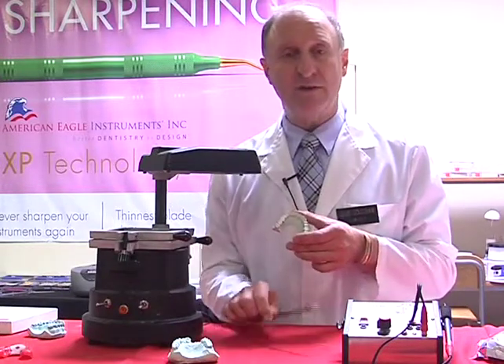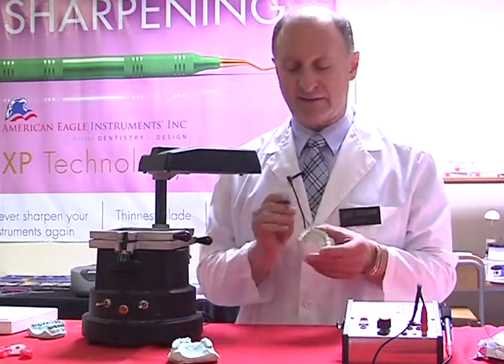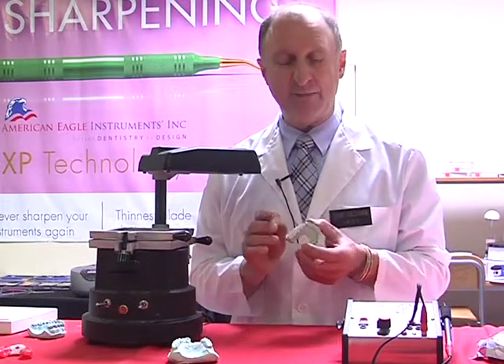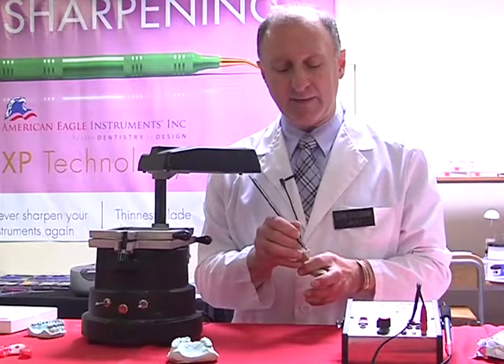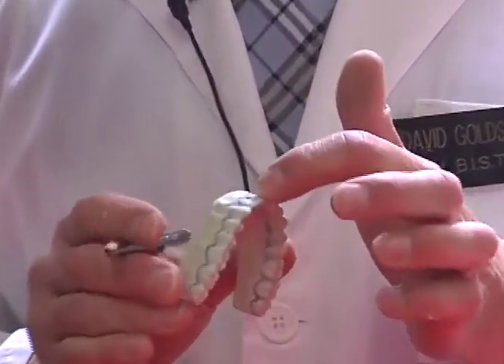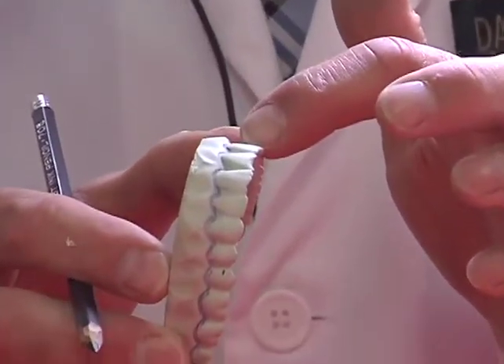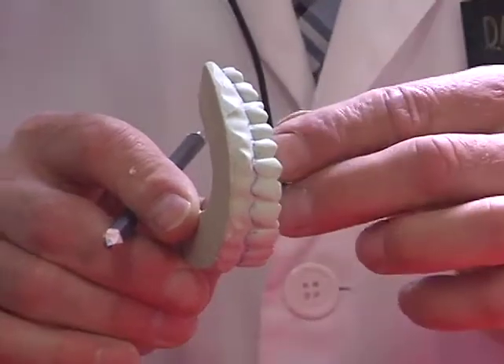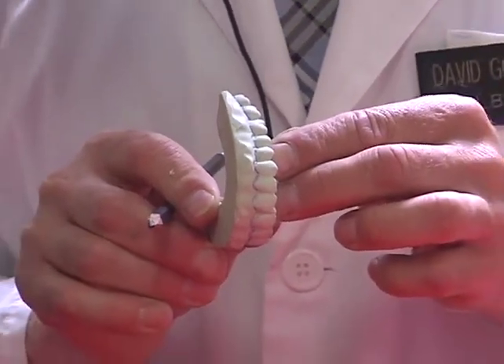Now, I also want to use, in this case, a very special pencil. It's called an indelible pencil. The indelible pencil, by lightly passing it through the gingival sulcus, marks and stains the area. That's important because when I'm trimming later on, I want to know exactly where to trim to.